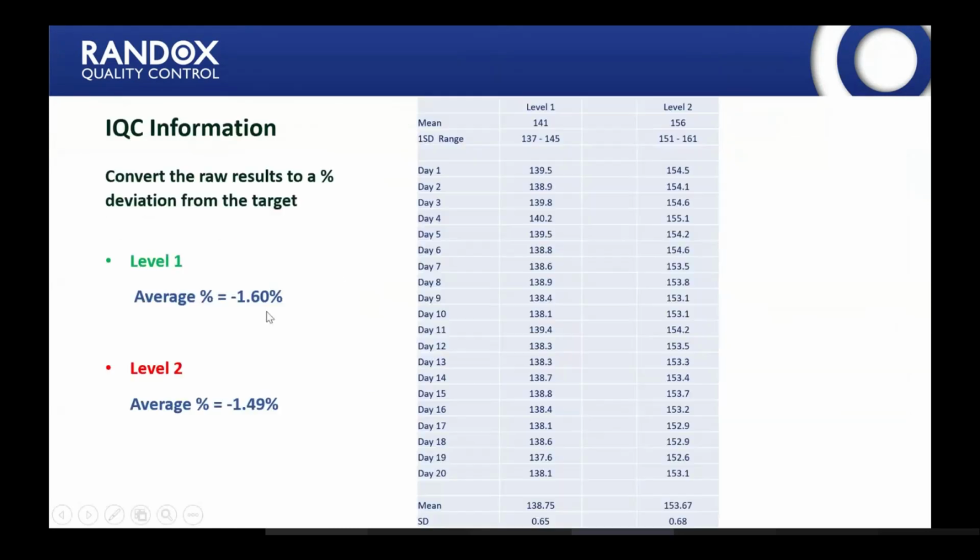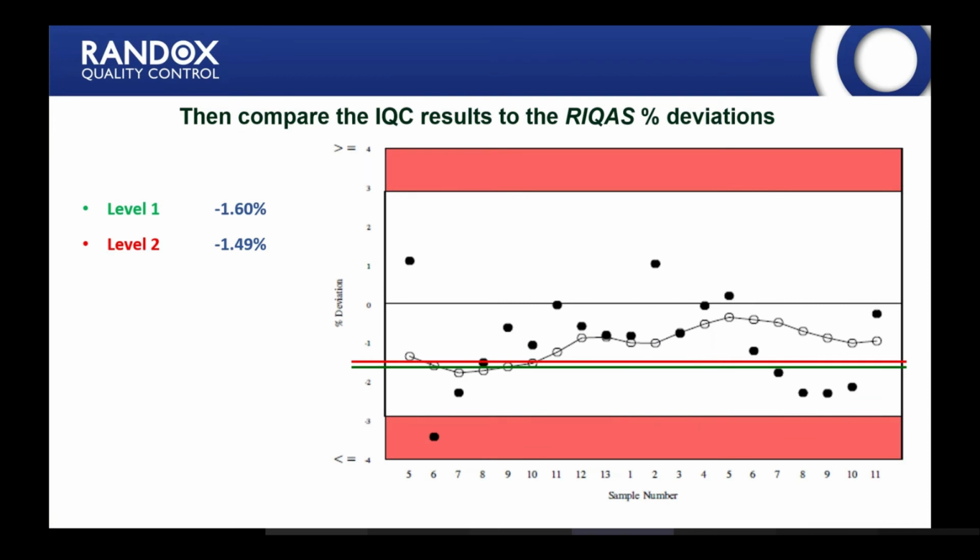And also, as you can see, even whenever we go back to their internal QC, you can see that they're running with a slight negative bias. Now, it's not great in terms of magnitude, but it still is a constant bias that they're running with, which is more noticeable whenever you're looking at it in their EQA. So, okay, is this the case that you should have with your internal QC? And the answer to that is no, because your internal QC, you should be fluctuating around the target. And this is one of the problems that you have with using a target which is supplied by a manufacturer.